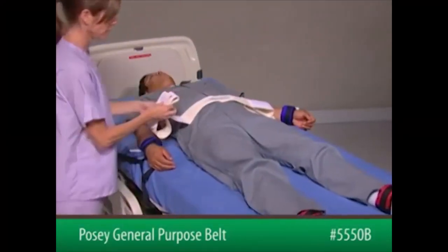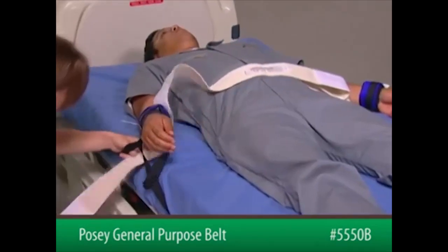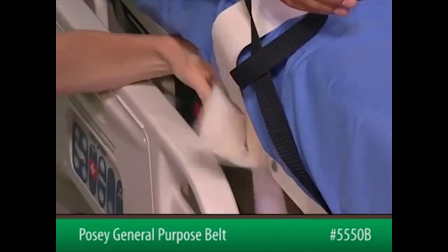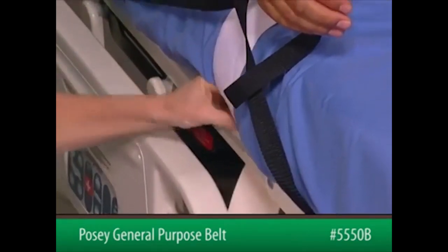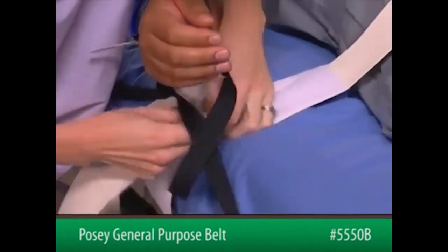To begin, place the loop end of the belt facing upwards. Thread one side around a movable part of the bed or stretcher frame. Bring the hook section of the strap up and fasten securely to the loop section.